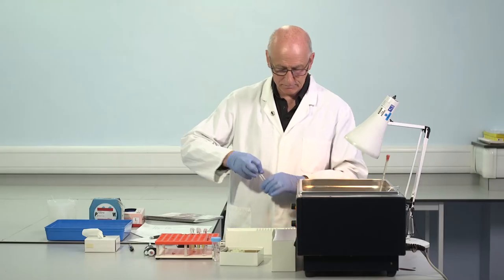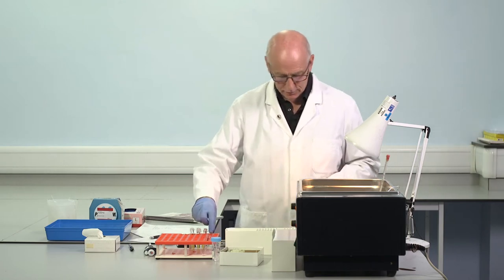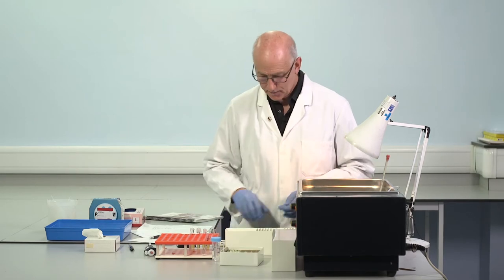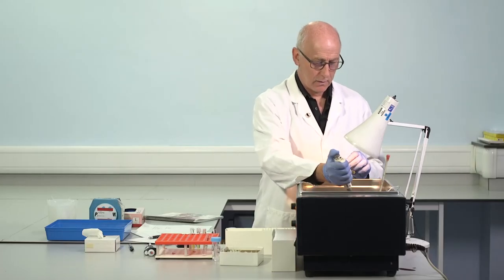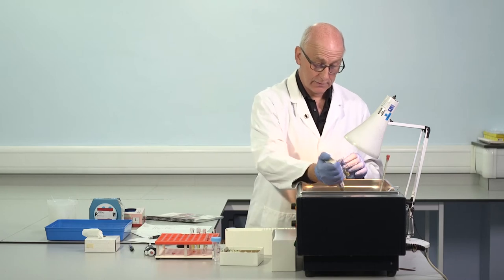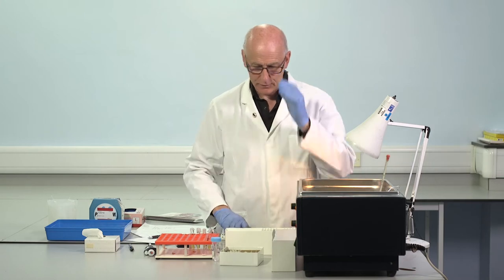So, second patient. Because of course we absolutely need the reference range in order to make an interpretation of the result that we've obtained. 2 glass tubes, second patient. First replicate, second replicate, 100 microliters. Just warming up to temperature.